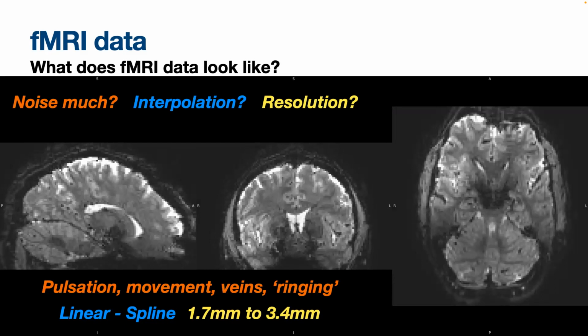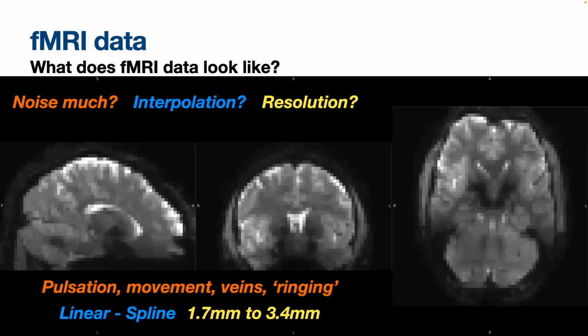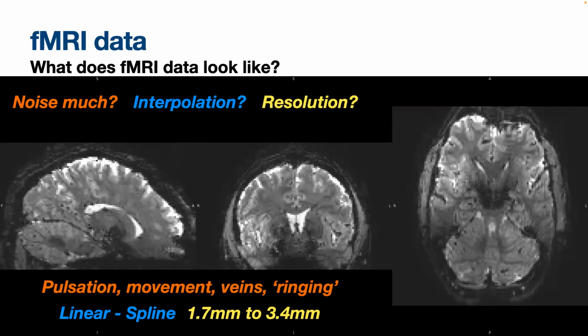Great, that's clear, right? We have beautiful images. They still don't have really the resolution and the fine detail that we would have in an anatomical scan, but at least we have it every 1.6 seconds or so. And this is acquired at a 7 Tesla scanner. You cannot get this level of detail at a 3 Tesla scanner. Yeah. Sorry, Rebecca.